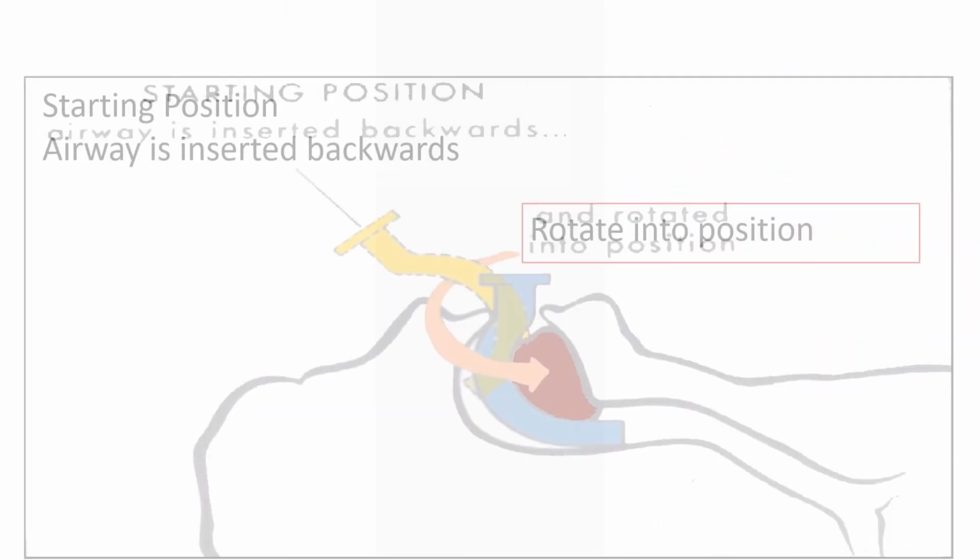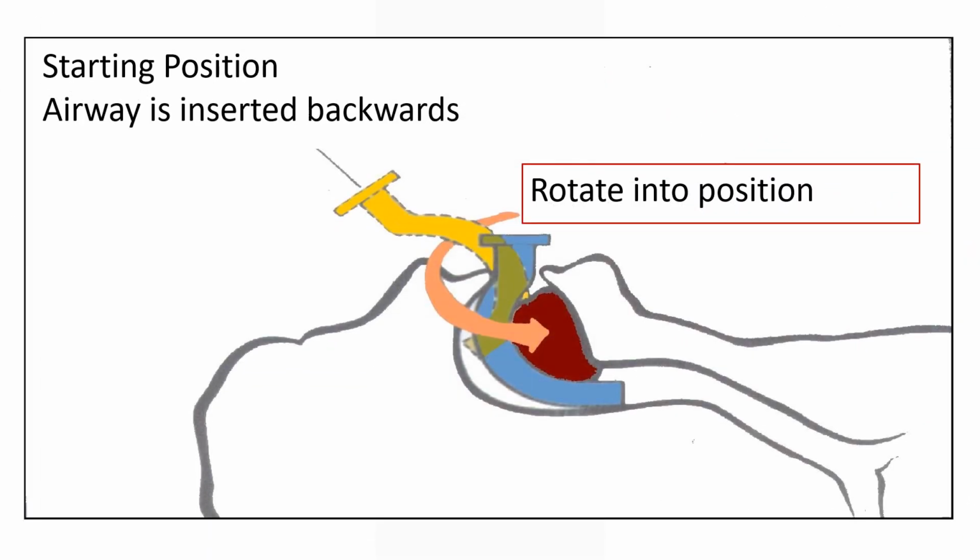Now, there are people who do this. How many put them in by putting them in upside down and then corkscrewing them in? I am not a proponent of that because you can really rough up the soft palate and then they're sore for days after and they wonder why. You can also make them bleed. So I'm not a proponent of that one.